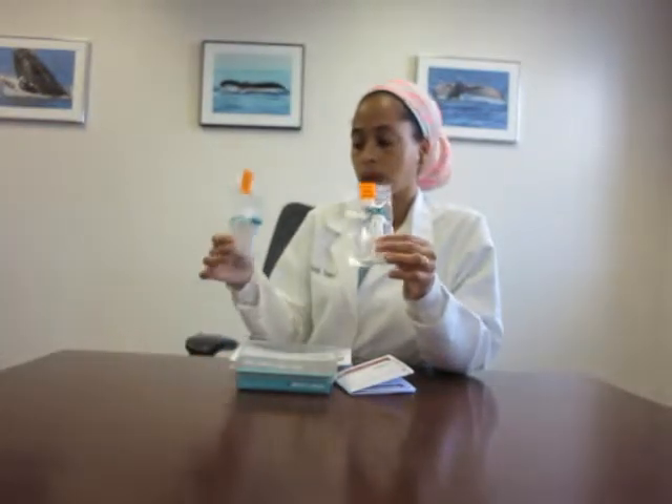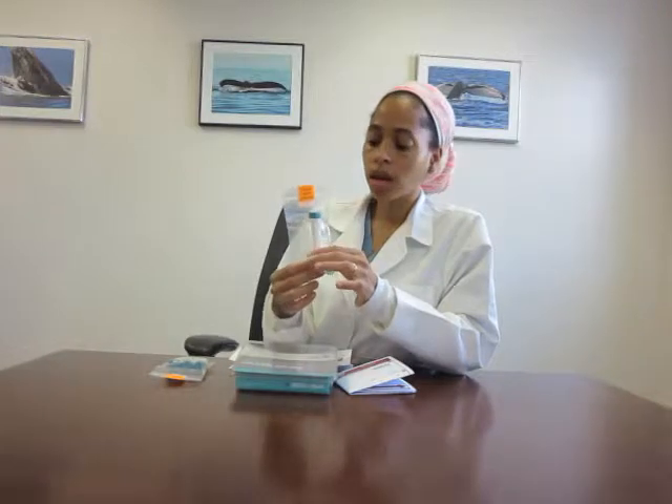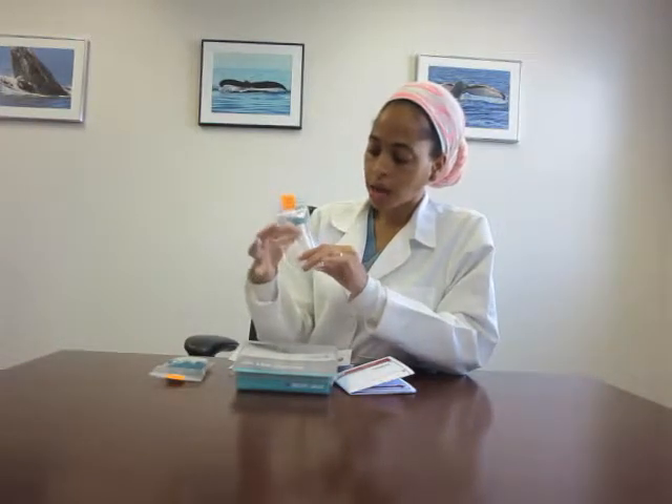Most of the kits that you get have four tubes. The biggest or the longest tube is your first tube to collect — you want to collect this a half an hour upon waking. And you want to fill it up at least half full; that does not include the bubbles, so without bubbles, try to get it at least half full.